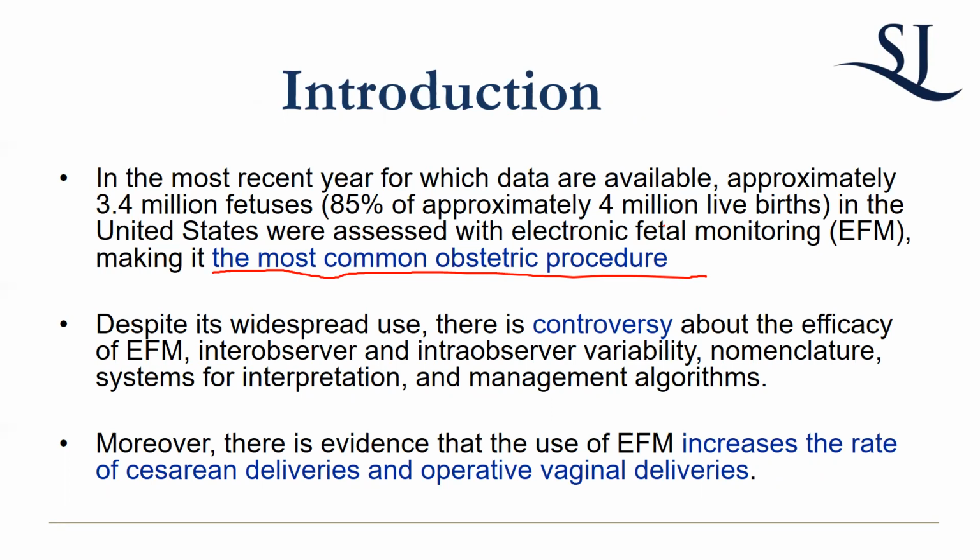So fetal monitoring doesn't necessarily mean continuous fetal monitoring, but almost every labor and delivery unit will have some sort of monitoring. Make no mistake that there's a lot of controversy about its use because there's a lot of inter-observer and intra-observer variability in interpretation and management algorithms, and really there's no evidence to suggest that this helps. It's been shown to increase the rate of cesarean deliveries and operative vaginal deliveries. That being said, it's not that they're completely ineffective. They have to be managed in the correct way, which is sometimes difficult. But if you truly have a good understanding of what it's telling you and what its limitations are, and put everything together, it's an essential component. And it's going to be used anyway, regardless of your opinion about it.